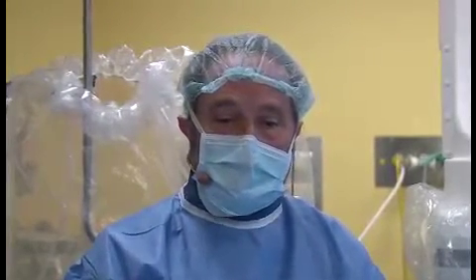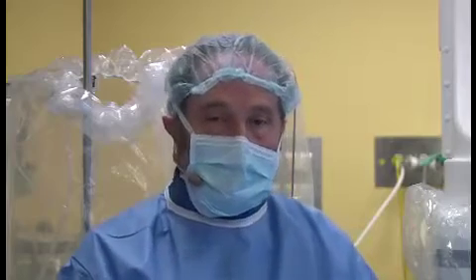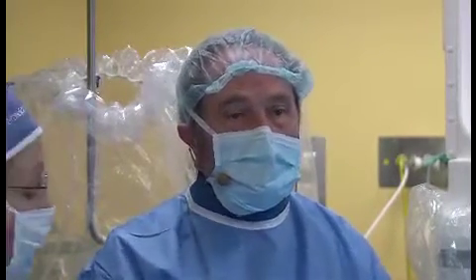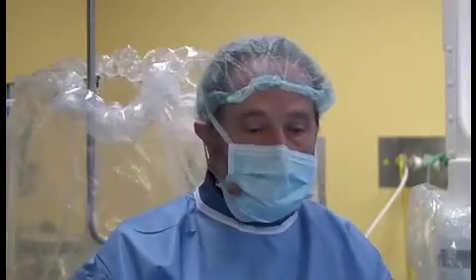In addition, if too much time is passing before releasing the device, there is also an additional potential risk of clotting in the sheath. So sometimes it's better to get the device out, flush the sheath, and start all over again with 100% certainty that there is no clot in the sheath.